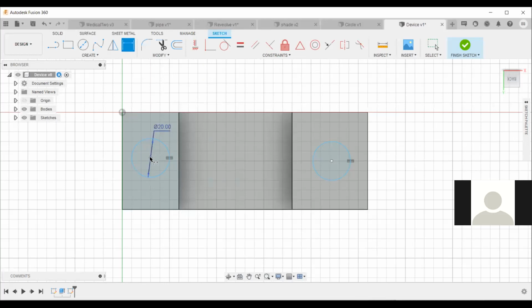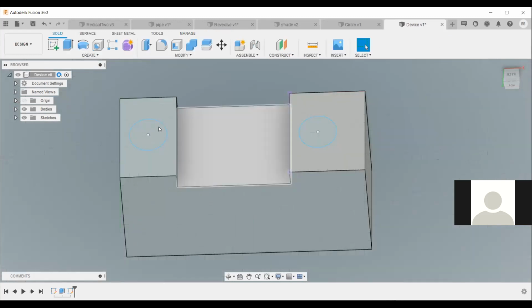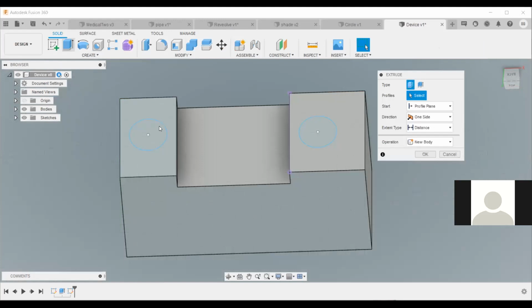Then you can say that from here, from the center to this, they have done 15. So you say 15. This other side also, from here to here, you also do 15. Guys, mnaona? Yeah, then we countersink. We finish sketch. So we want them to be extruded all through.